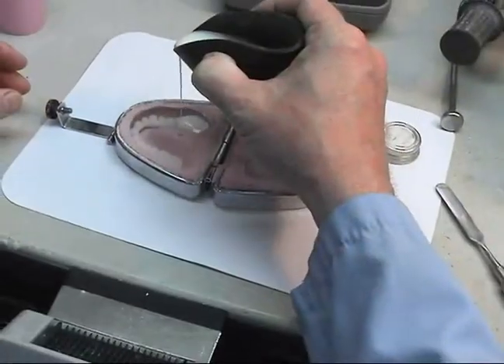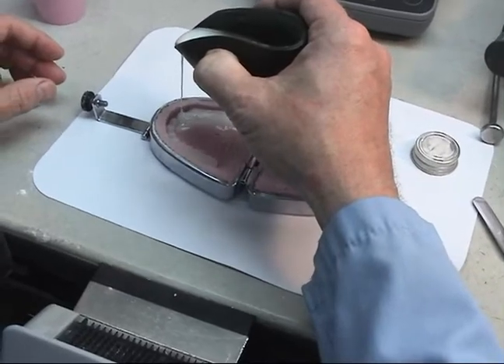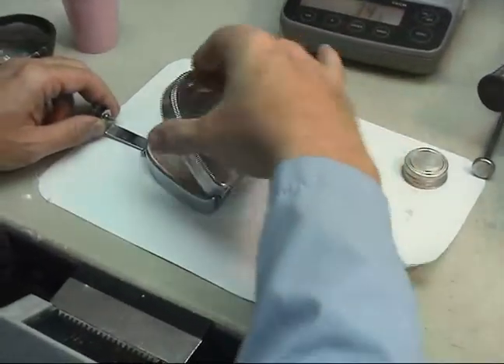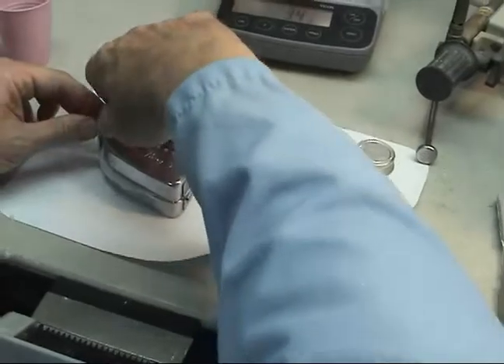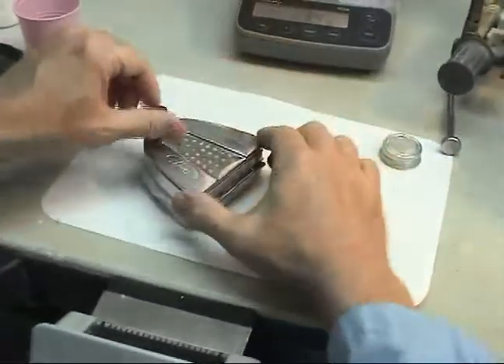The base and flange of the denture were poured subsequently with 10% barium sulfate and acrylic resin by weight. The flask was closed and clamped tightly, and the material was allowed to set in a pressure pot.